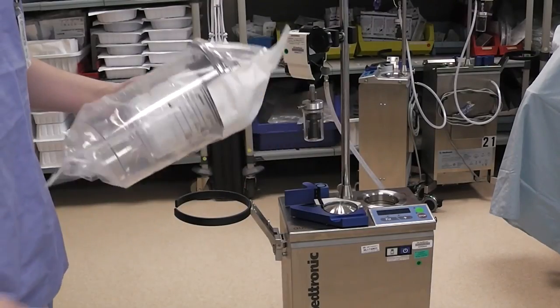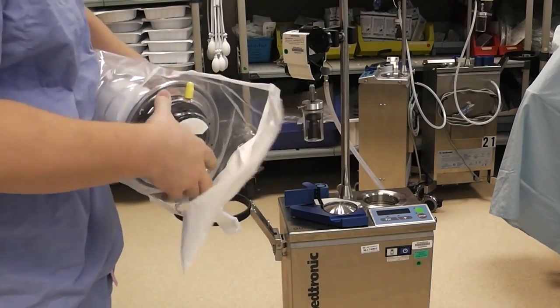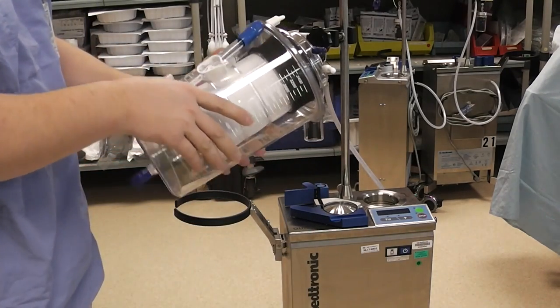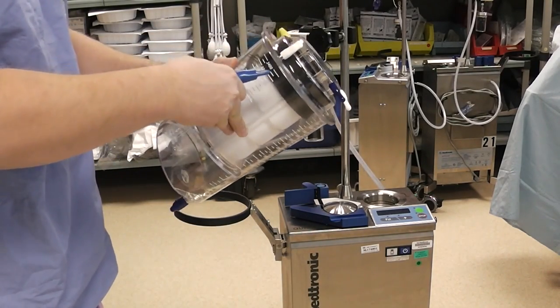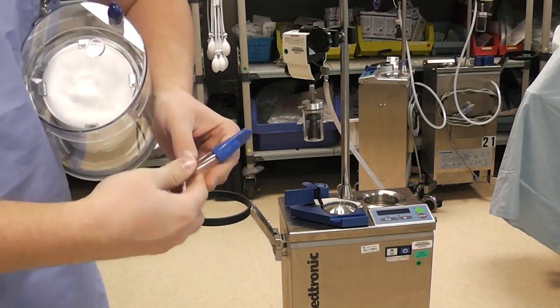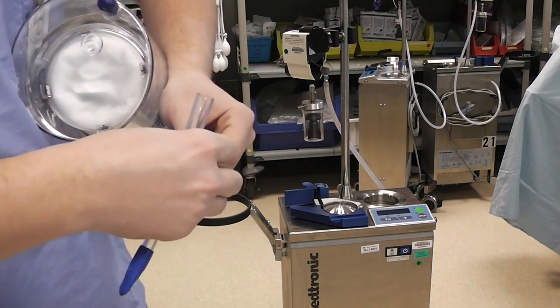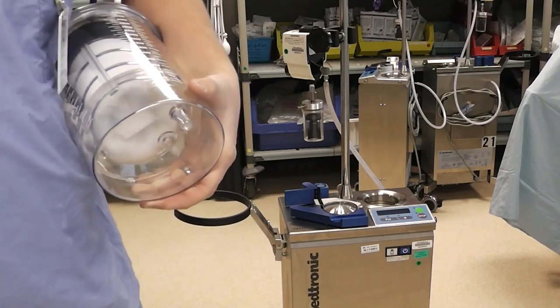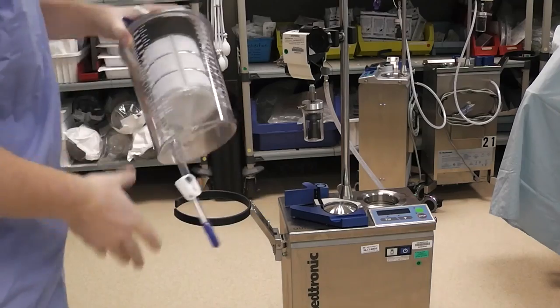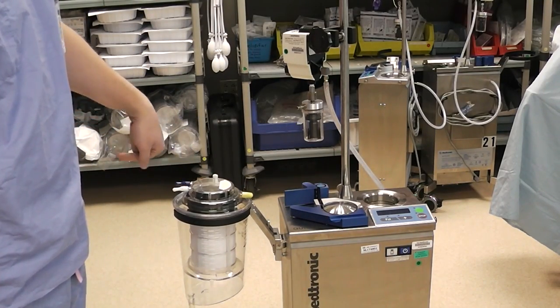We will begin setting up the cell saver with the reservoir. We will take it out of its pack, making sure to check for any loose caps as we take it out. We will take off this piece of tubing on the side which is held on by a piece of tape. This tubing is actually tapered — there is a narrow end and a wider end. We are going to take the cap off the wider end, the cap off the bottom of the reservoir, put that tubing onto the reservoir, and put it into the holder on the side of the cell saver with the blue and white caps facing outward.